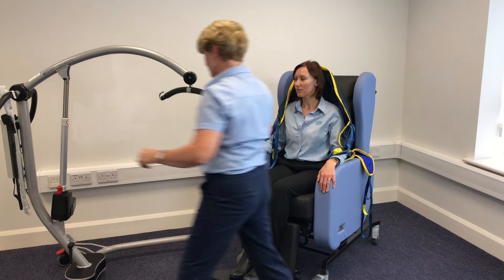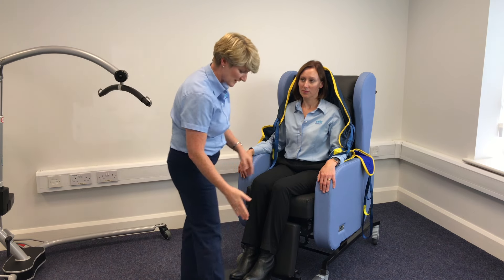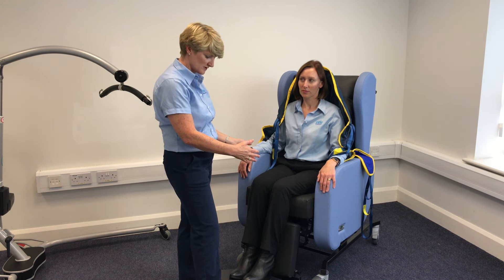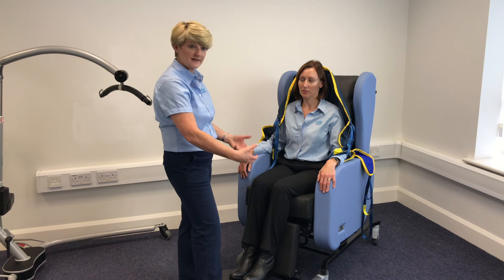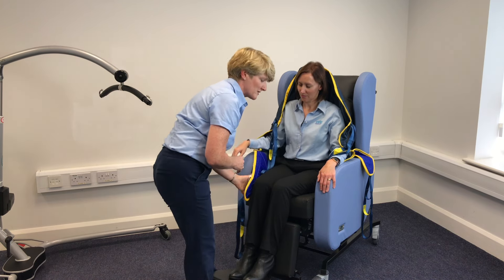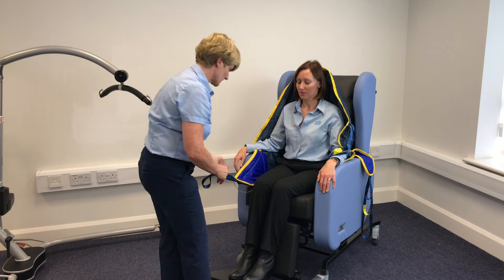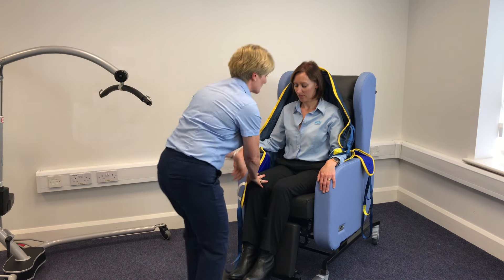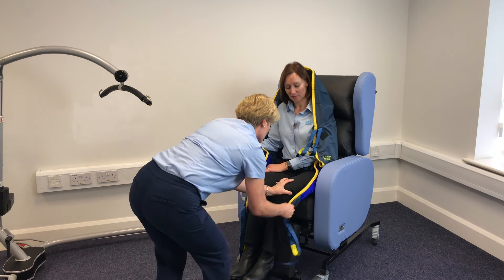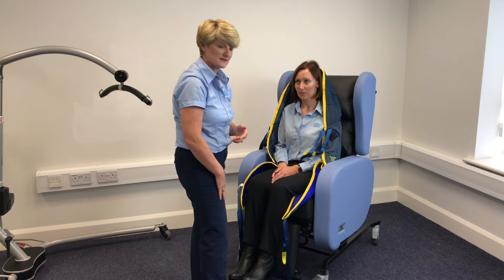You then need to come around to the front of the chair and leave your hoist out of the way. I find a lot of people will flip up footplates too early — leave your footplate in place because then I won't have to lift Deirdre's leg. If you get rid of the footplate early, you then have to lift the full leg up. So just bring your leg pieces around to the side. It's actually better if there aren't too many people putting on a sling, because if there are too many hands on deck, everybody's just pulling from each other. So you just catch the leg piece and give it a pull forward. You will notice that the slings I'm using have sliding sheet material on the legs, and this makes application of the sling a lot easier.